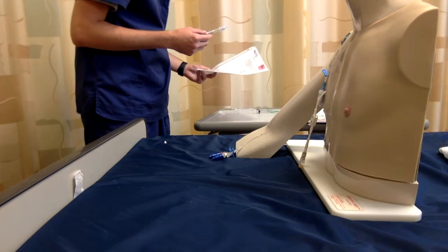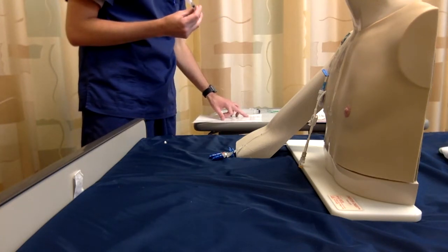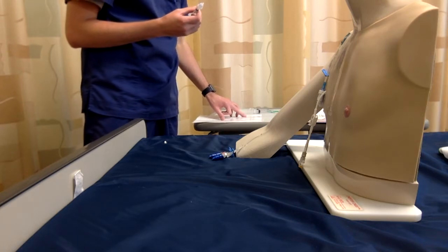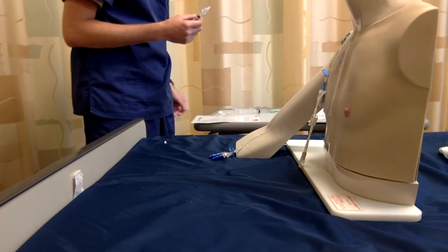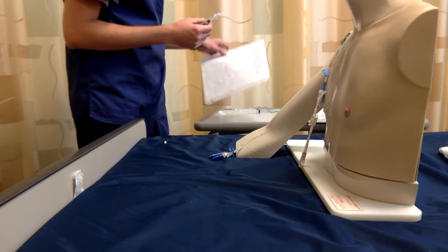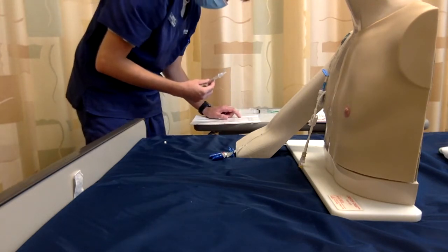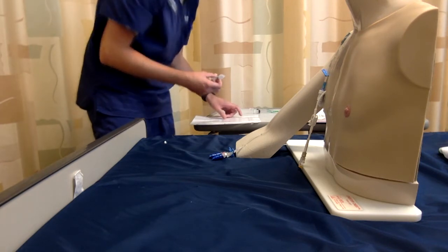Bob Owens, 922.33, getting Lorazepam 1 milligram IV push over 2 to 5 minutes at 12:20. Bob Owens, birthday 922.33, getting Lorazepam 1 milligram IV push over 2 to 5 minutes at 12:20.